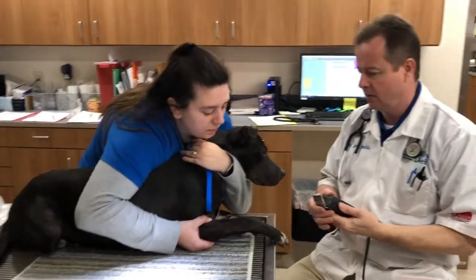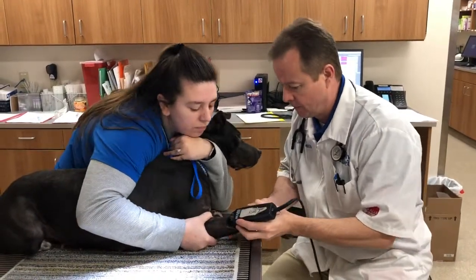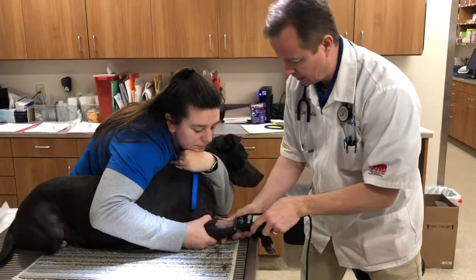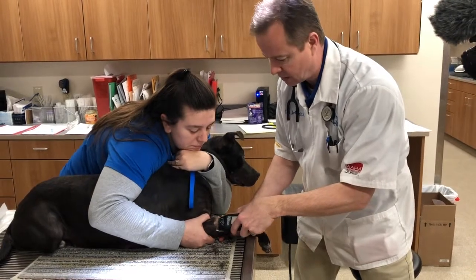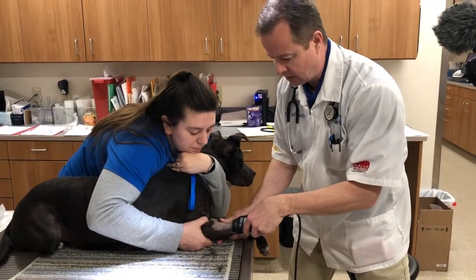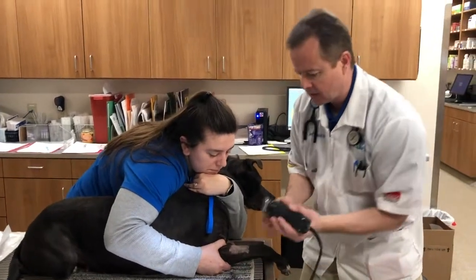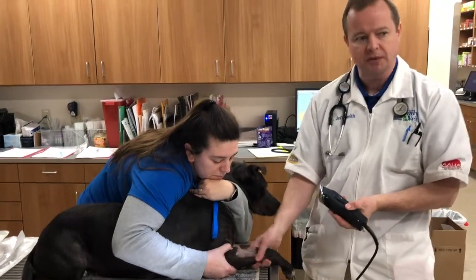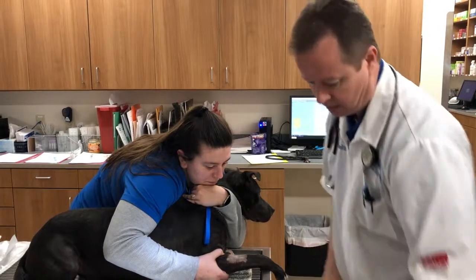So I want to show you how I place an IV catheter. One of the things I do when I run the clippers is — imagine the clippers are just running along the skin and you're not actually touching the skin. You want to try to remove the hairs without even touching the skin. A lot of times I see people trying to get that last little bit and they start digging, scraping the skin, and you can cause a lot of irritation, especially when we go to the next step of using our scrub.